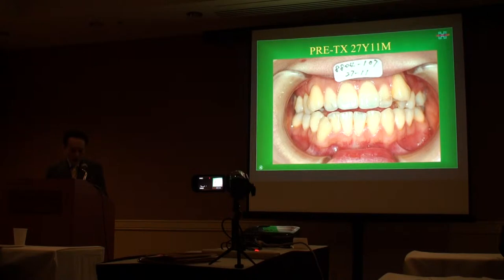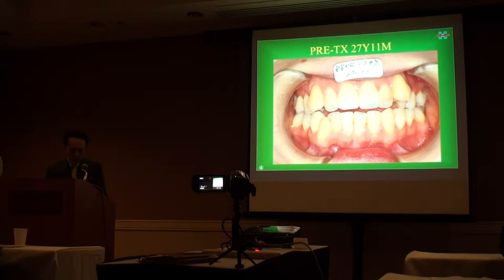The frontal view of the dental arches. The anterior teeth show open bite and crowding. The dental midlines were deviated, with the lower dental midline 3 mm to the right of the upper midline. The overjet was 5 mm and the overbite was -2 mm.